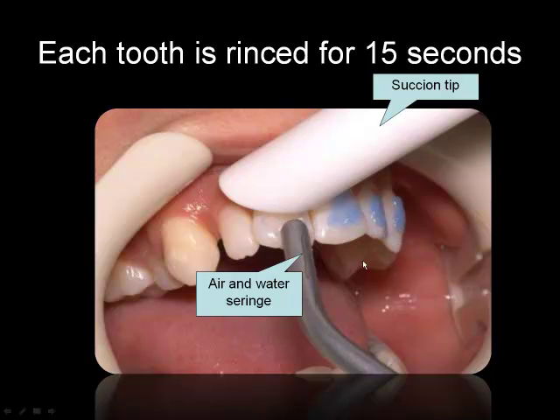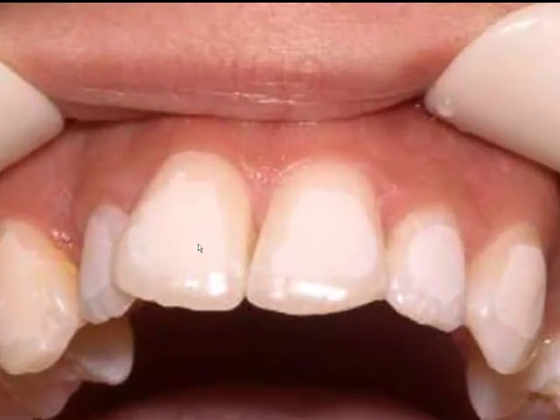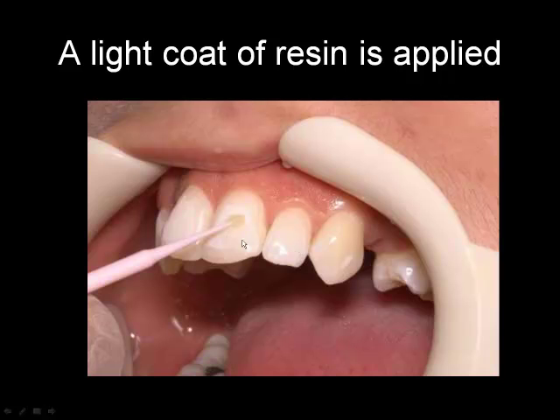Then we rinse and remove this blue material with air, water, and a suction tip. As you can see here, the teeth are now getting a little bit frosty — this is where the bonding agent will be applied. Then, as you've seen here, we put a very light layer of bonding agent.